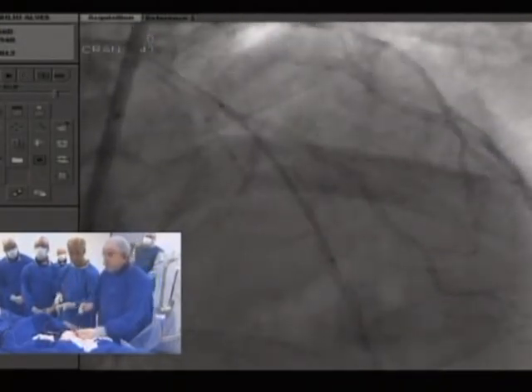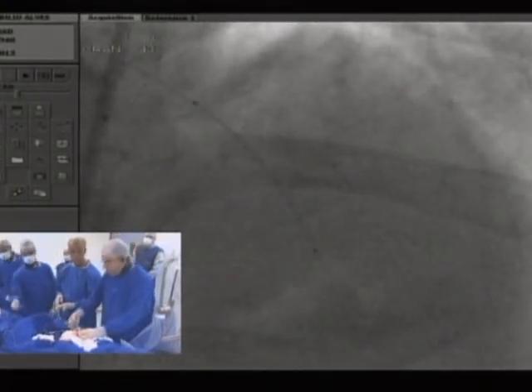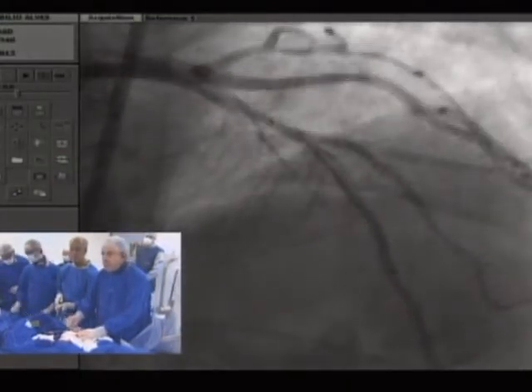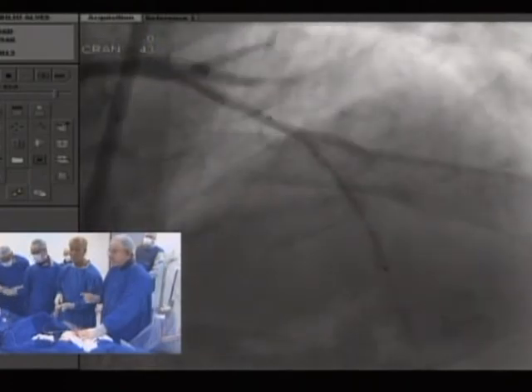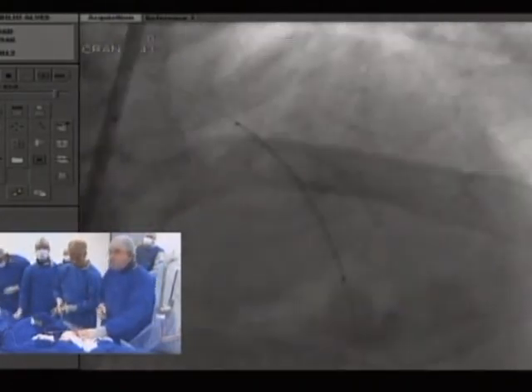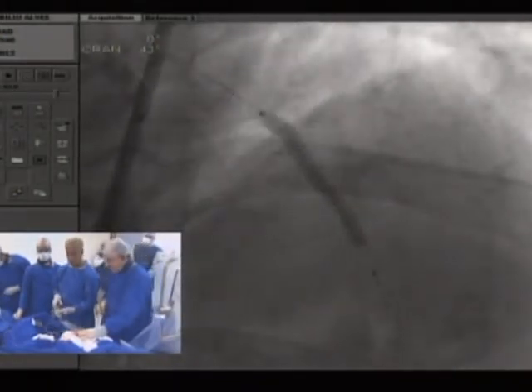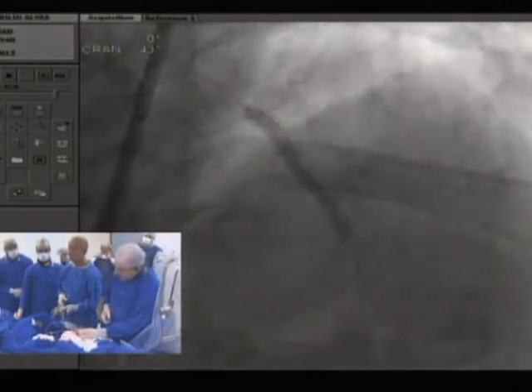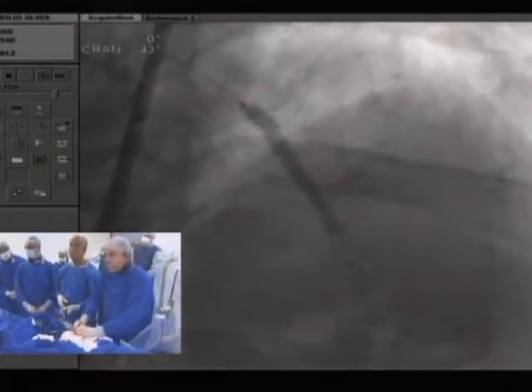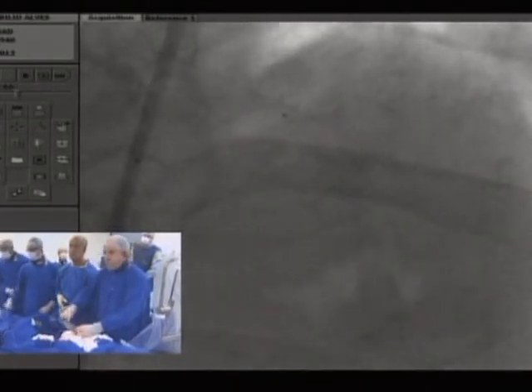Now we're going to deploy the LAD. See, the reason why I keep the wire in is you have an orientation of where the ostium is, and then you use the flip-flop of the two wires. Yeah, I think it's a little bit easier to rewire. Well, we'll see. How many atmospheres? 12.